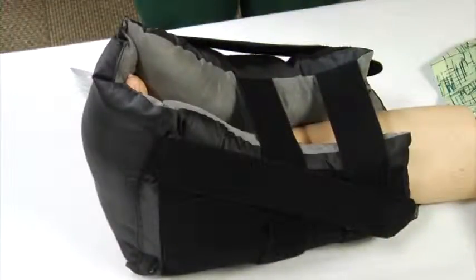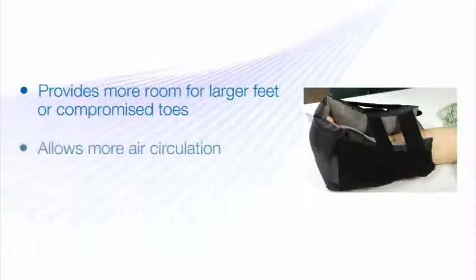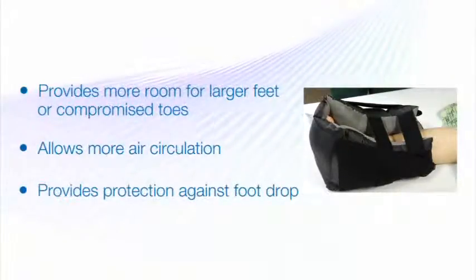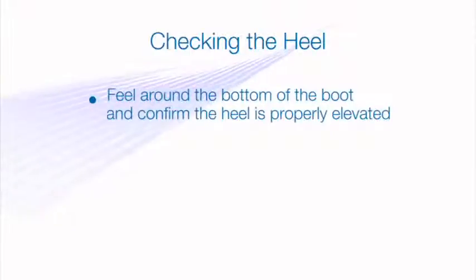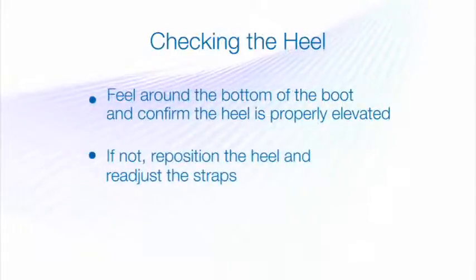Make sure the strap doesn't touch the patient. This strapping option provides more room for larger feet or compromised toes, allows more air circulation for a cooler foot, and provides enhanced protection against foot drop. After you have secured the lower 2 straps, either option 1 crisscrossed or option 2 same side, check to see that the heel is offloaded properly. To check, feel around the heel opening at the bottom of the boot and confirm that the heel is properly elevated. If it isn't, reposition the heel and readjust the straps.